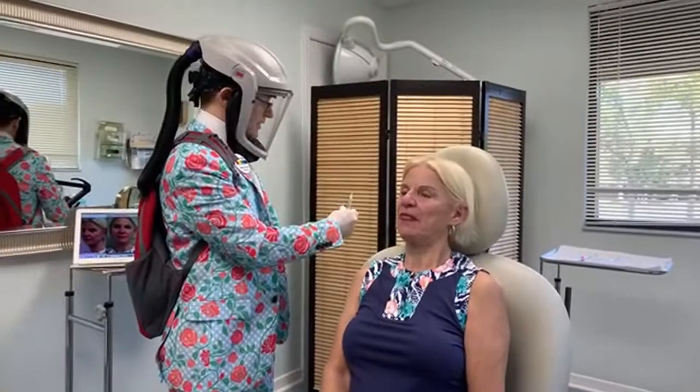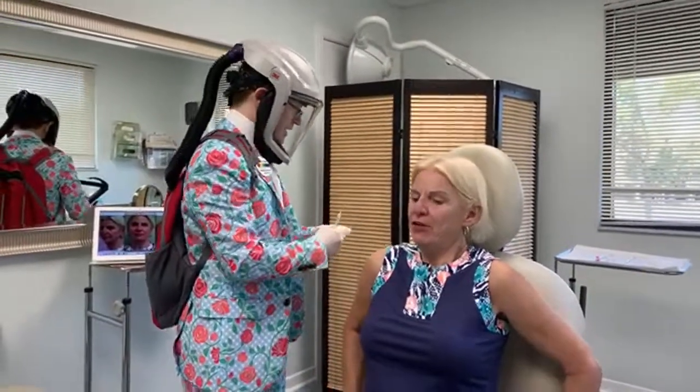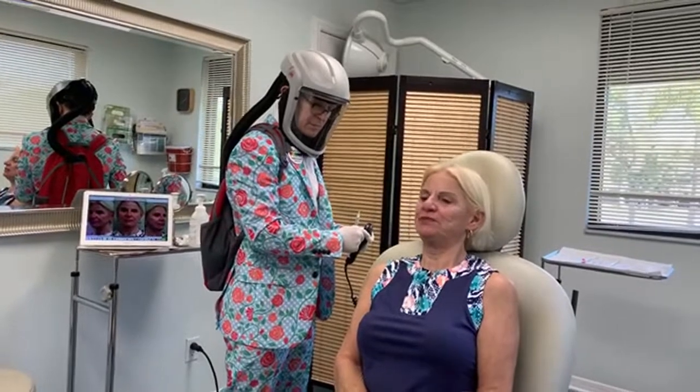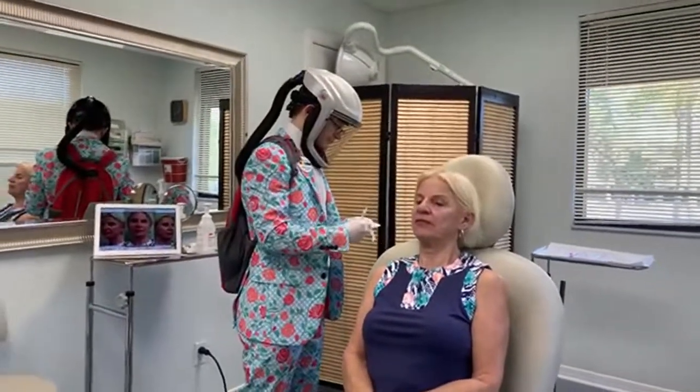So I like to use my little buzzer device here. So I'm going to do a little bit of the numbing medicine. Can this back go back a little bit? It's a little uncomfortable for me. Yeah, that's much better. Is that good? And yeah, raise that feet up. That's good. Does it feel good there? That's fine. If you need to adjust, you let me know.